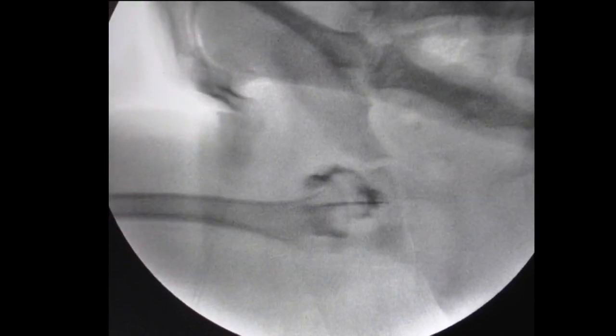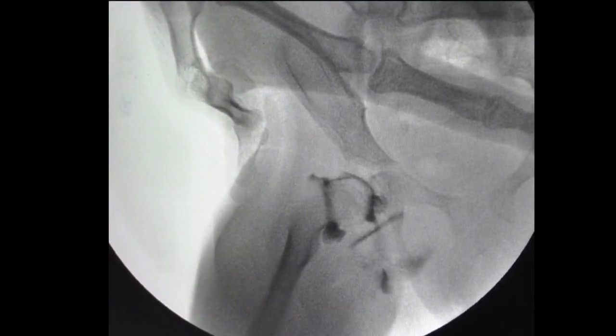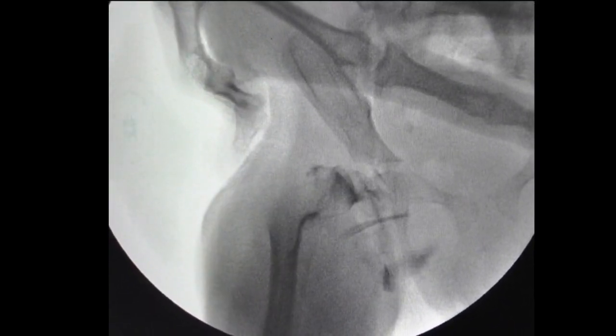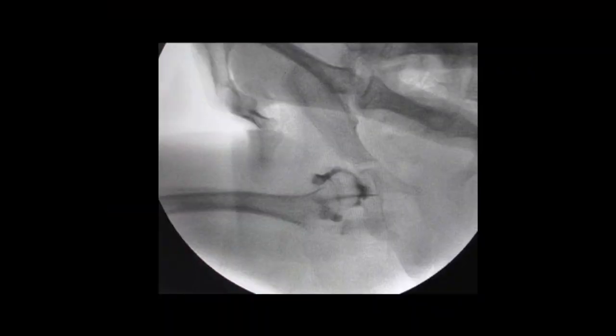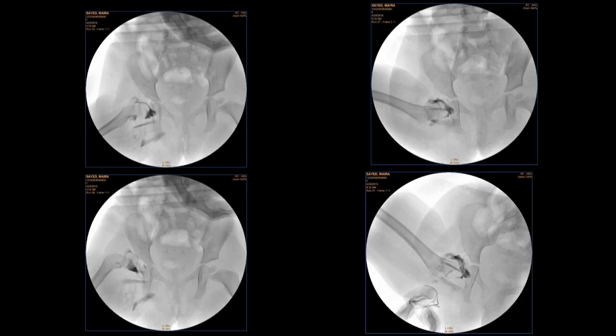Then gradually you adduct to find out the point at which it dislocates. The medial pooling of the dye should be less than 2 mm. This is the hip in various positions to make sure that your reduction is concentric and confirmed.